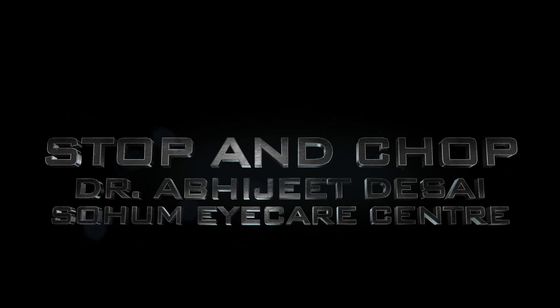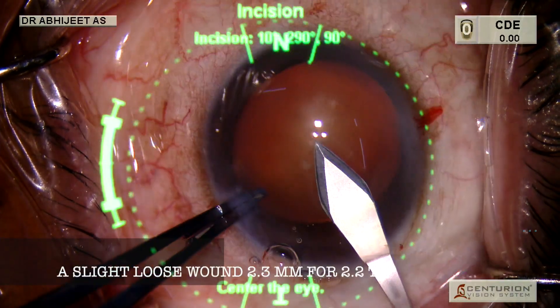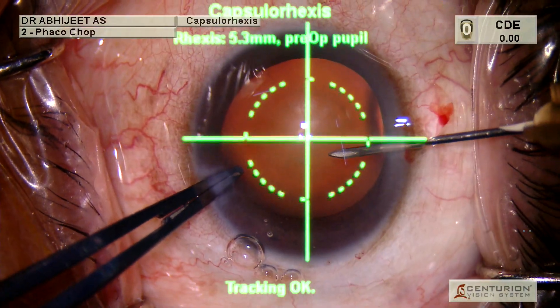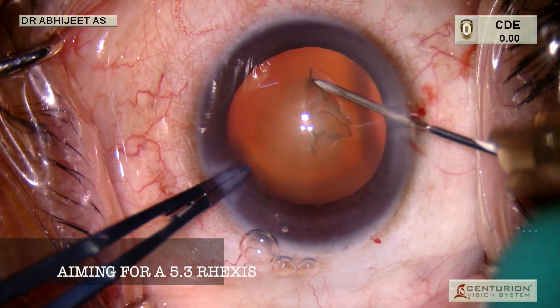Here we demonstrate stop-and-chop techniques using Ozil. We use a dispersive OVD and start with a rhexis of around 5.3 millimeters using an assiTome.